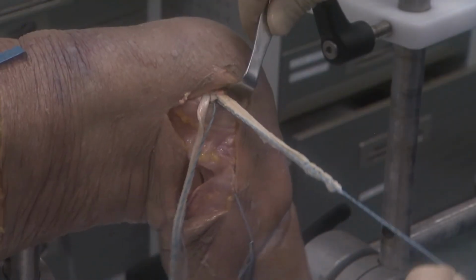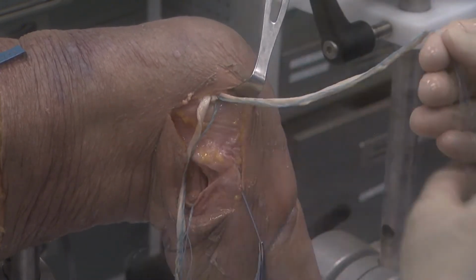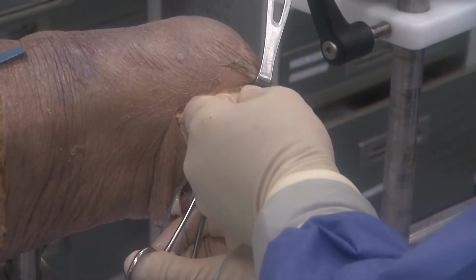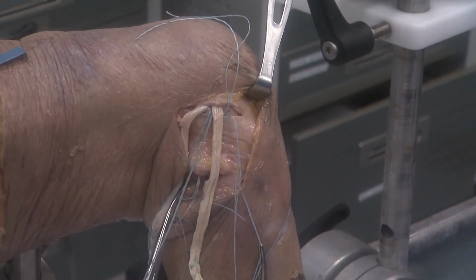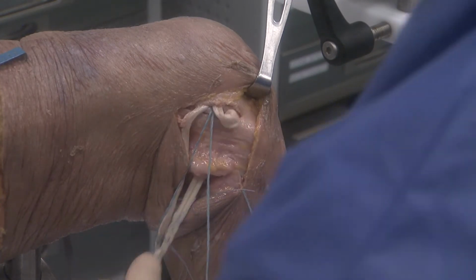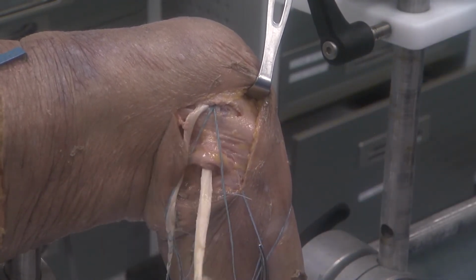So I want to pass my popliteus more posterior in the back of the knee, and I do that by creating a tunnel deep to the iliotibial band, deliver my clamp into the wound, and deliver it into the posterior aspect of the knee like this. Now it's ready for passage into the tibial tunnel.